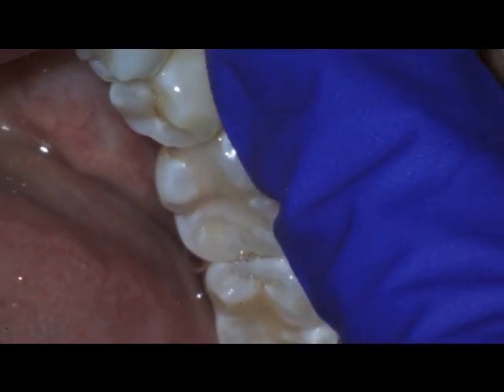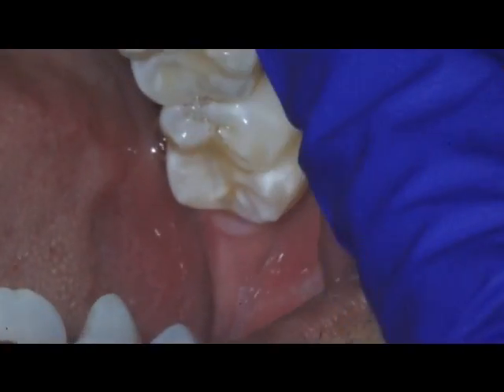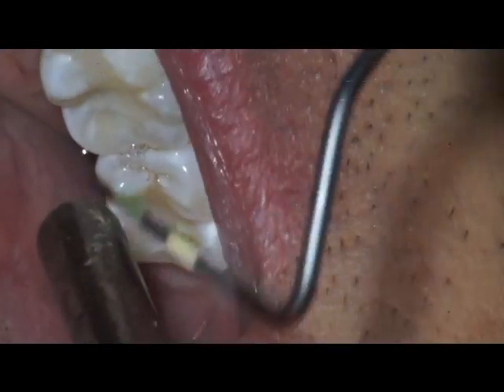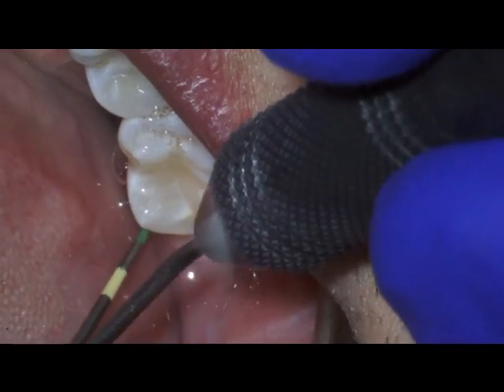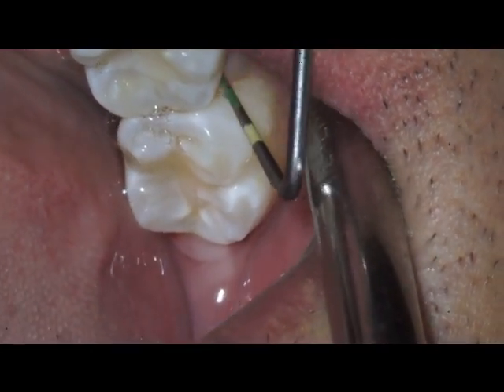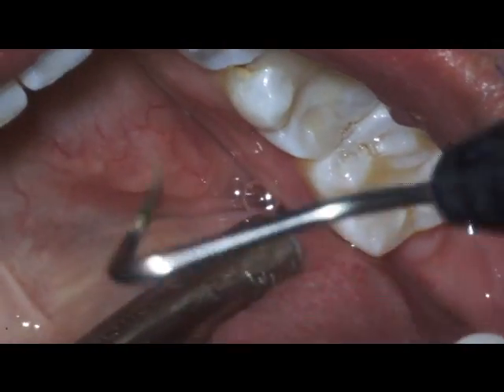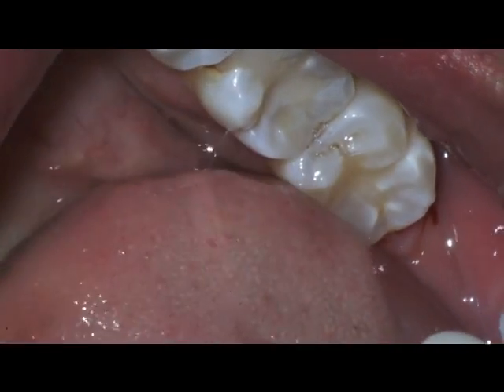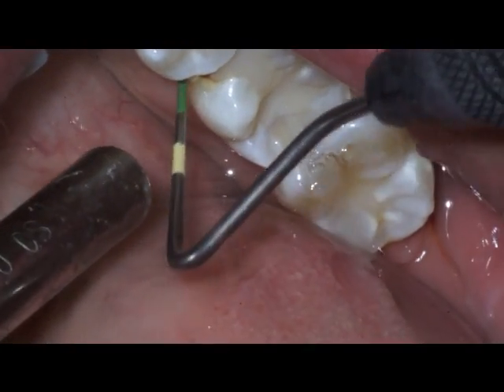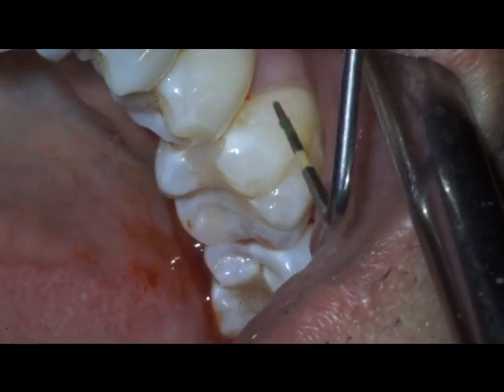On number 31, we had a 9 — distal and distal buckle, distal lingual, distal. And on the mesial of the lingual 31, another nine. And 30, the lingual mesial lingual 30, and the distal lingual 30.